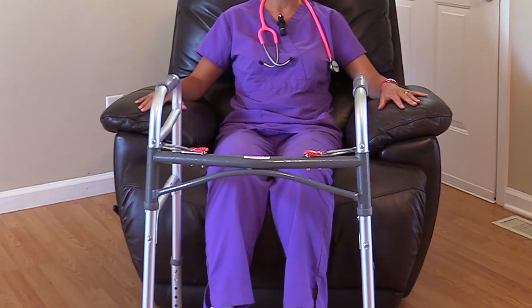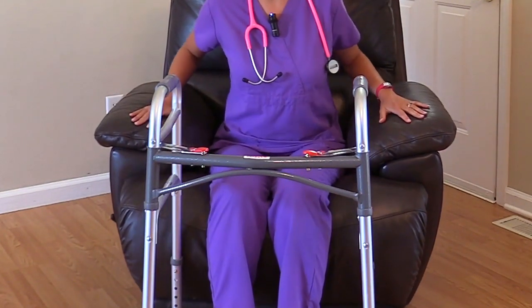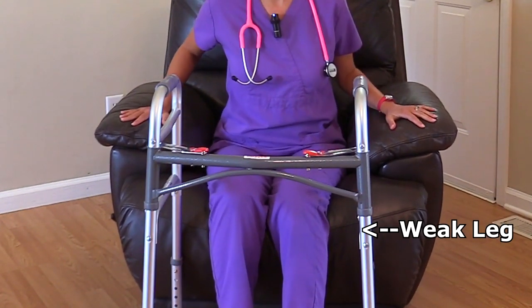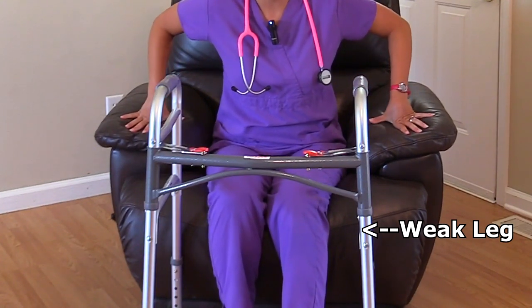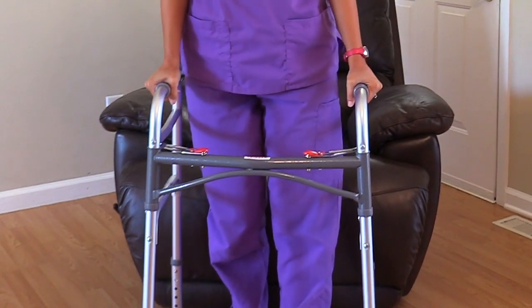To get up from the chair, the patient is going to make sure the walker is out in front of them. They're going to lean forward out of the chair, make sure their hands are on the hand rest, and slightly extend that weak leg out. Then they are going to put weight on their hands by pushing up on the armrest of the chair with their strong leg, and putting their hands on the hand grip of the walker.